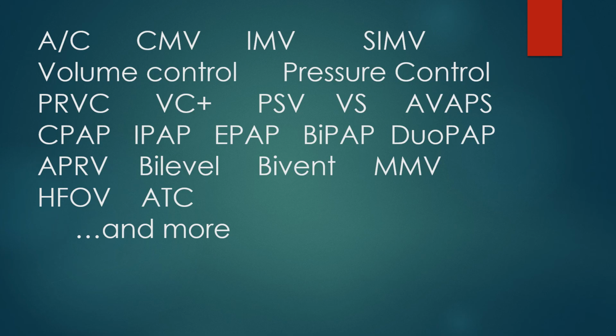So the patient and the ventilator weren't very synchronous, and so they just invented SIMV, and the S stands for synchronous. And with SIMV, the patient would not have breaths delivered to him while he's trying to exhale. The machine would wait until the patient made an inspiratory effort and then give him an assisted breath.